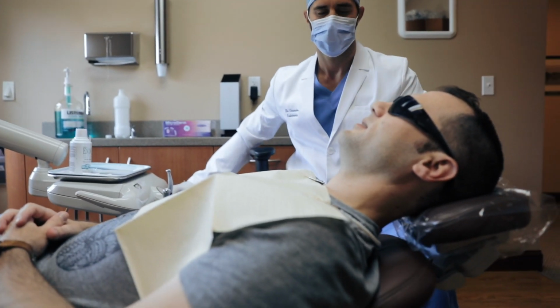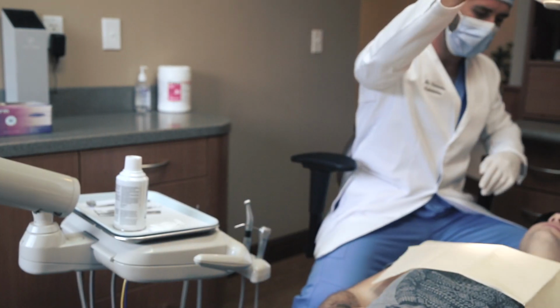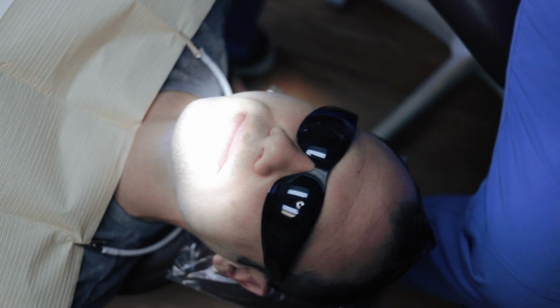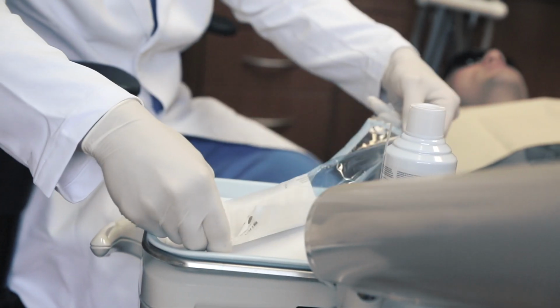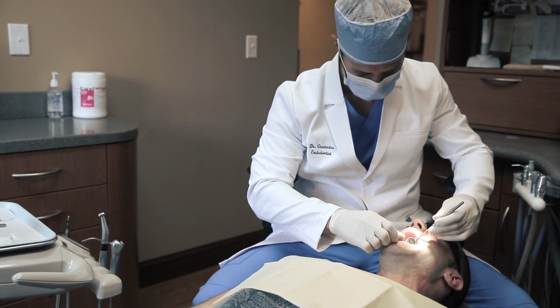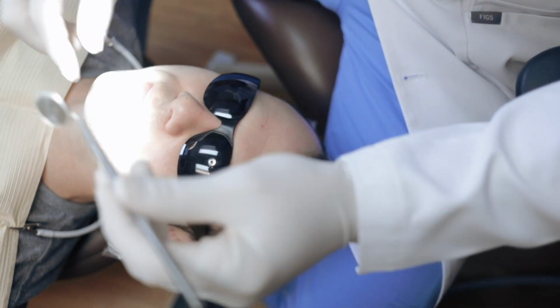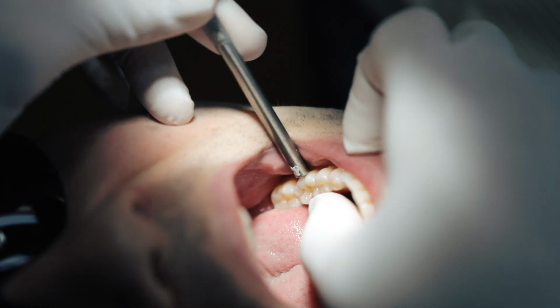Then go ahead and recline the patient and start by performing your intraoral exam in the area of interest. Now, 9 out of 10 times after hearing their story and reviewing their radiographs, you should know exactly which is the problem tooth. So look for intraoral swellings indicating acute apical abscess, sinus tracts indicating chronic apical abscess, caries, cracks, or any other major issues with that tooth.